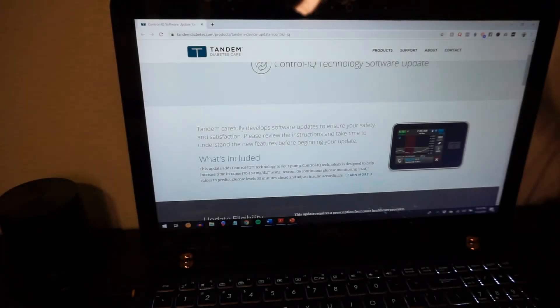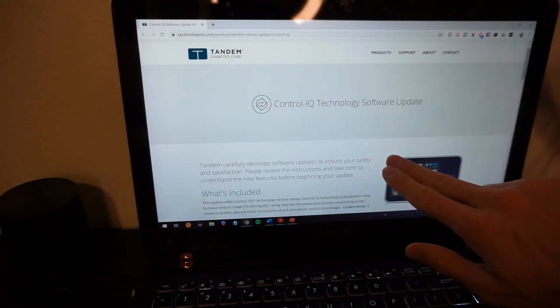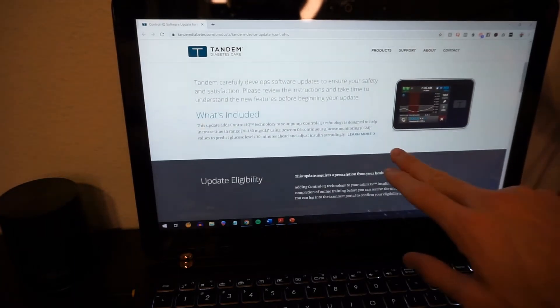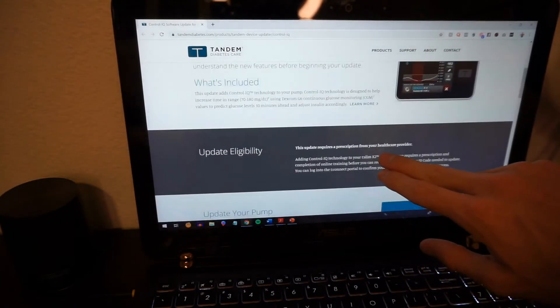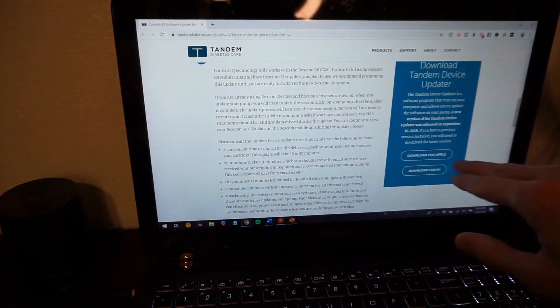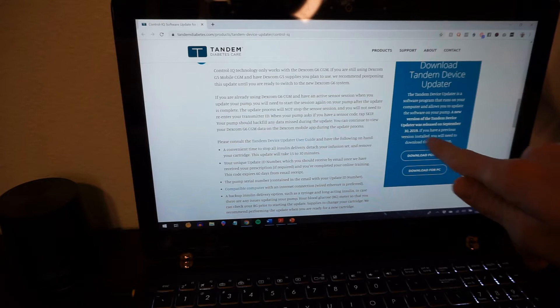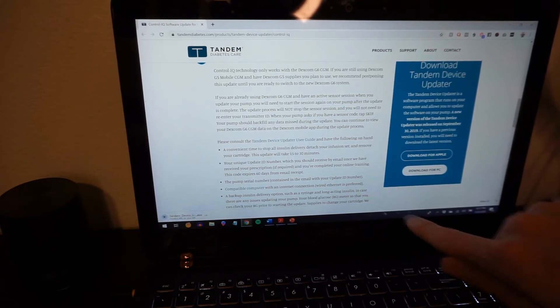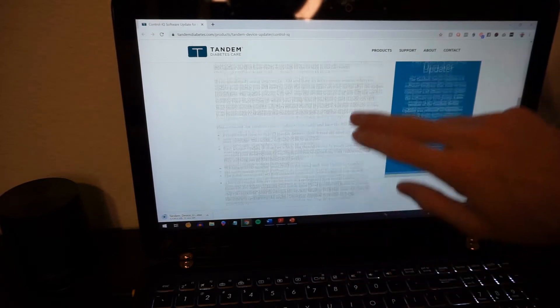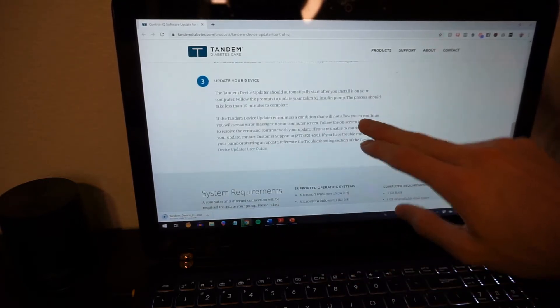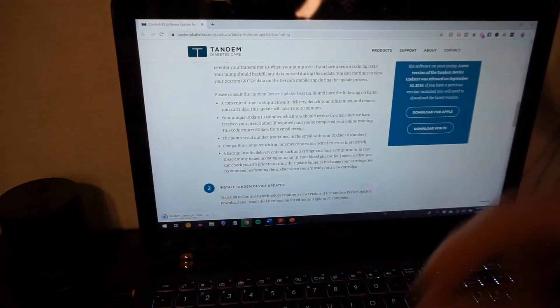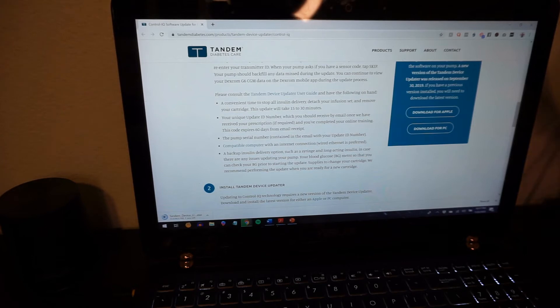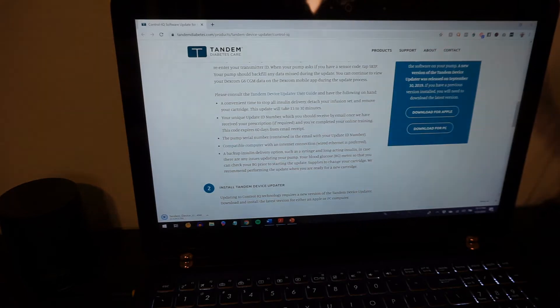All righty, guys, as you can see, we've got the Control IQ technology software update. This is once you have your own link from them after you complete your quizzes. You get to update your pump, and you're going to have to download this. See, last time I updated it was Bazel IQ, which was before the update, so I have to download a new one. So I'm going to download that, which is popping up right there. Just kind of read through this, install tandem device updater, update your device. Everything looks good, so I'm going to wait for that to upload. You're going to have to grab your charging cable in order to plug your pump into your PC, and then you can begin the update process.